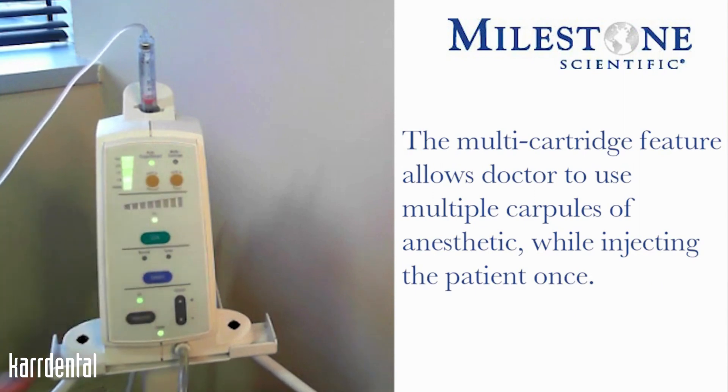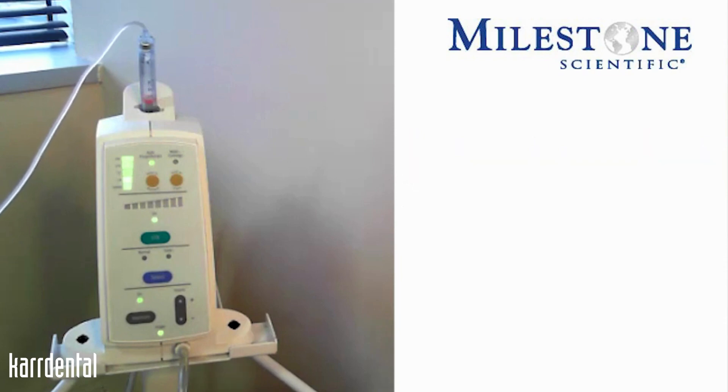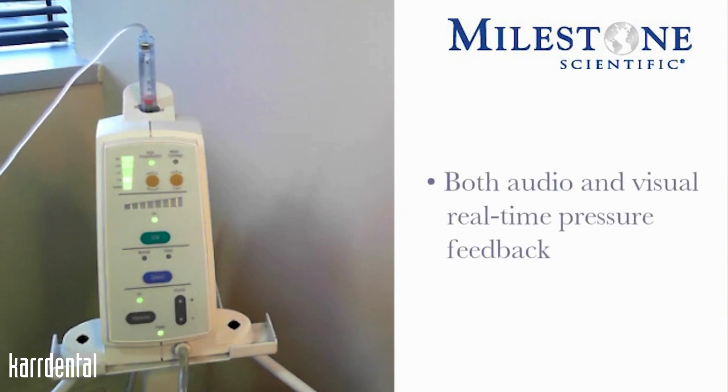There are two gold buttons, one of which is a hold-to-train button. The hold-to-train button gives you positive voice prompts to the different sounds and tones associated with the instrument. The instrument has both audio and visual real-time pressure feedback. When that training mode is activated, it's basically going to give you a tone and then tell you what that specific tone is and what the instrument is doing.